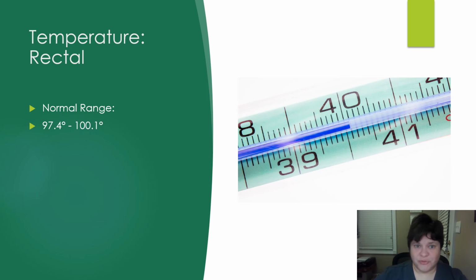Now, I want to tell you a little story about taking temperatures. I worked with a group of students once, and they were very eager to help. They wanted to do anything they could on the unit. It was the first, second day of clinical. And so myself and the other nurses, we asked them if they could take temperatures for us, or vital signs. Well, I saw one of them come out of a patient's room, and they were holding one of the thermometers. The thermometer had a red tip.